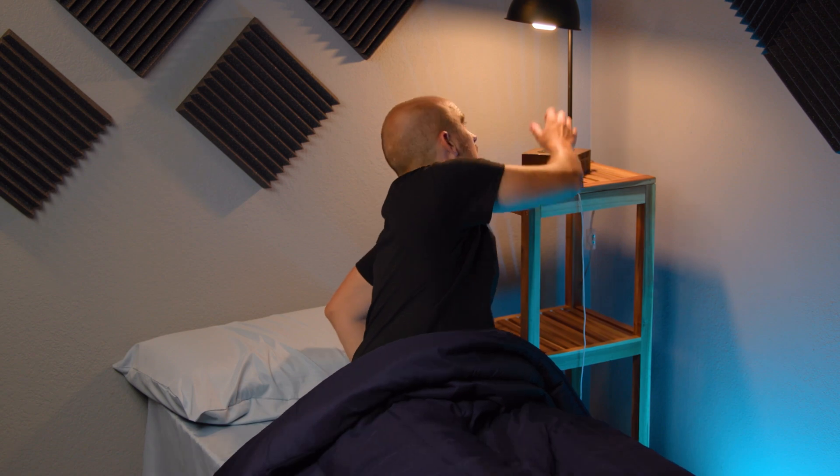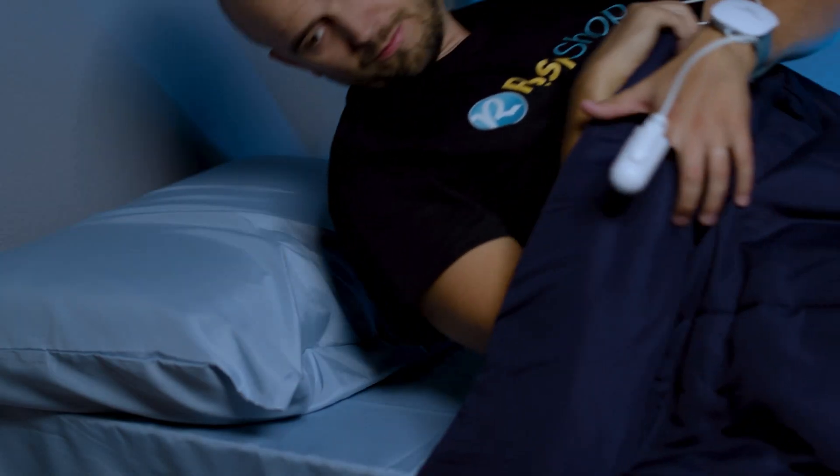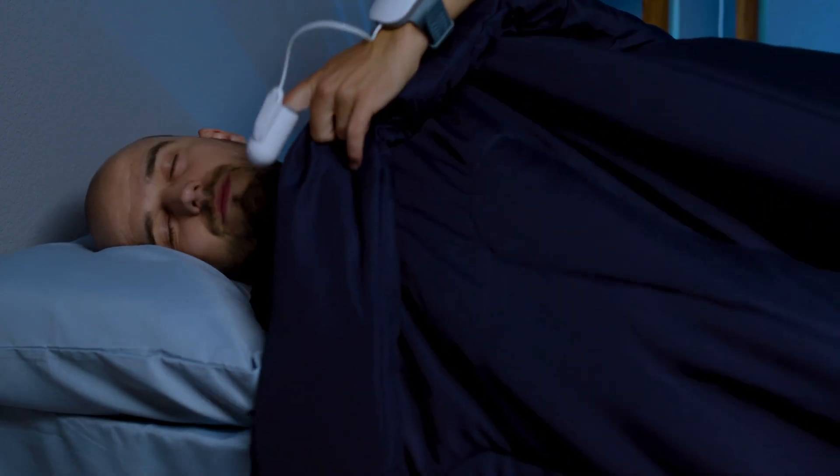Once you're set up, it's time to go to sleep as normal and the kit will measure various data from your sleeping. The WatchPAT does this by connecting to your smartphone and storing the data in an app, which then is sent to a sleep technician in the morning for analysis and a sleep report to be compiled. Once you have your sleep report, your doctor can use it to diagnose any sleep disorders that you may be suffering from, and you can then consider your therapy options.